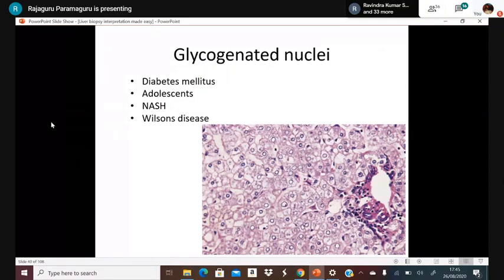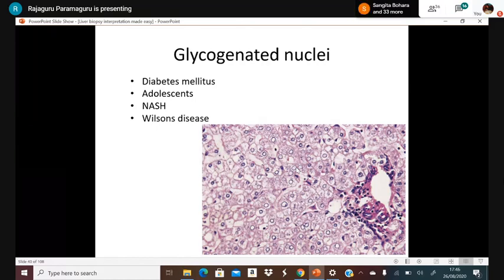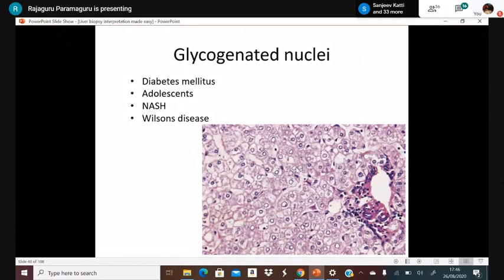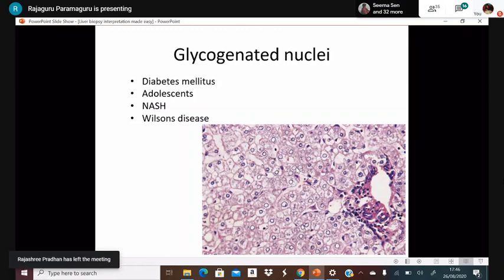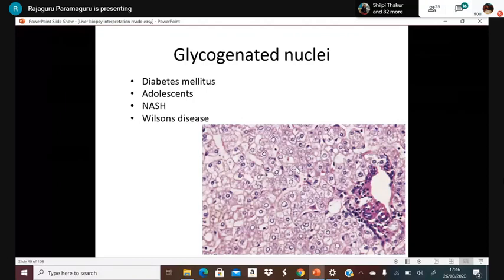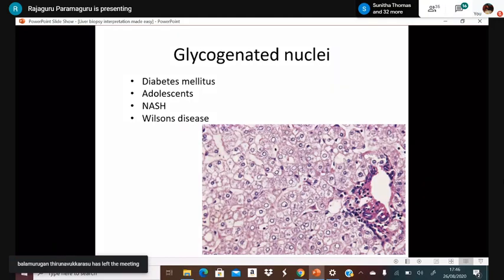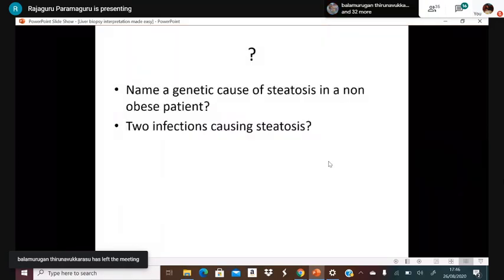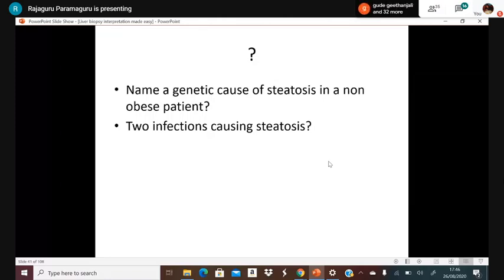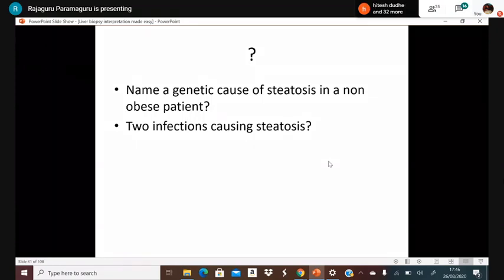Glycogenated nuclei: the nucleus of hepatocytes shows a pale, clear appearance. This is seen in diabetes mellitus, and in adolescents up to age 14 to 15 years it can be a physiological change. It is also seen in NASH and Wilson's disease. Do not confuse glycogenated nuclei for viral inclusions.